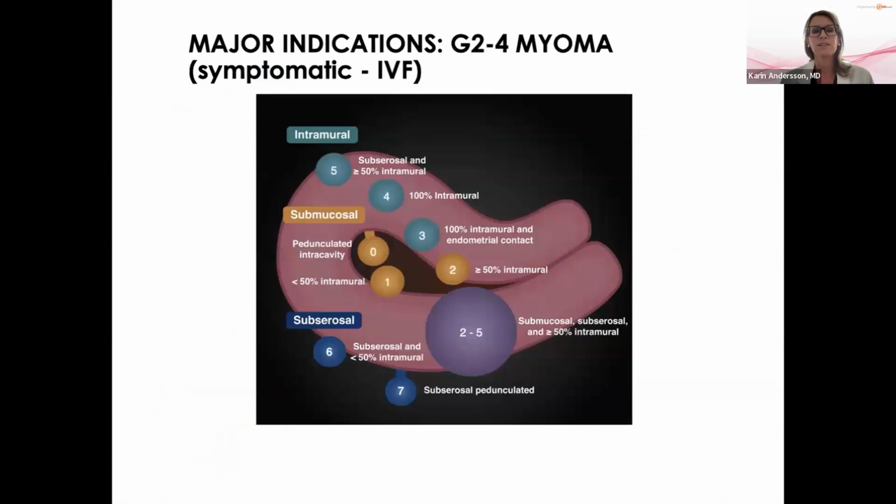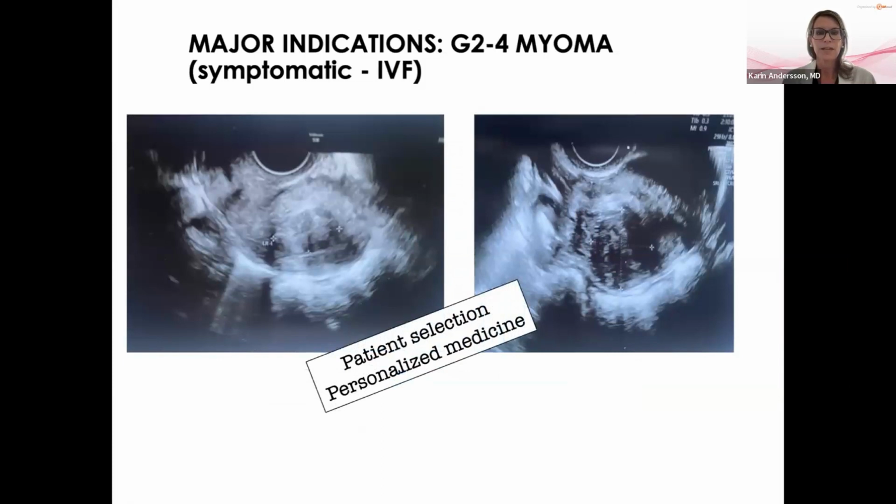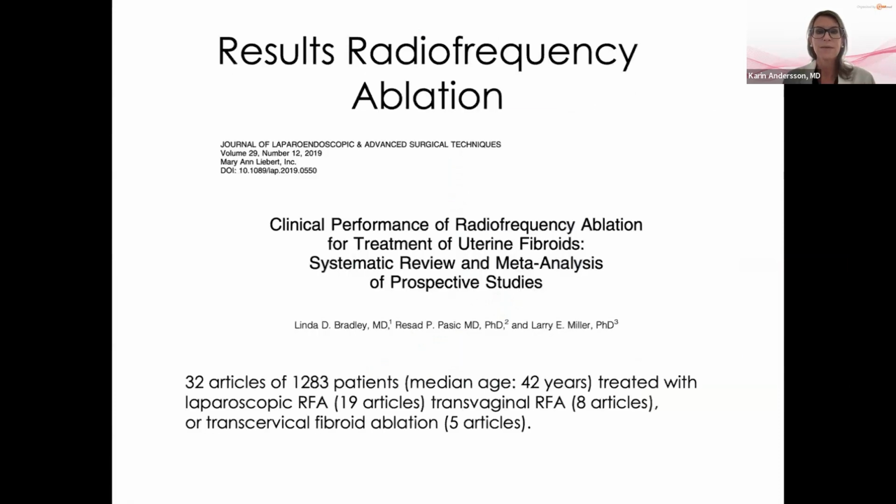Sometimes it's really an indication to have a fibroid treated when the woman needs to go to IVF in the next coming months or within a year, and we don't have time or possibility to do surgery. So, for instance, these fibroids we have treated with good effects after 3 months. These are both women that were going into IVF procedures. Again, patient selection is important to offer good personalized medicine.